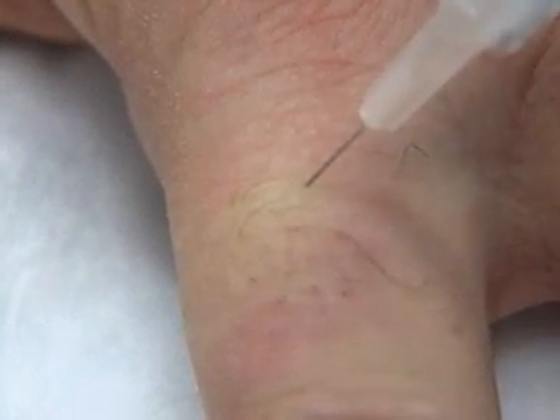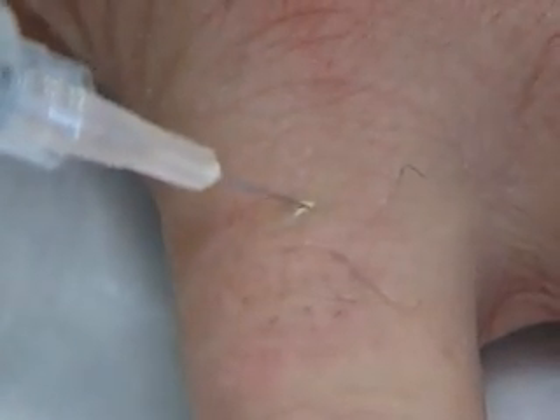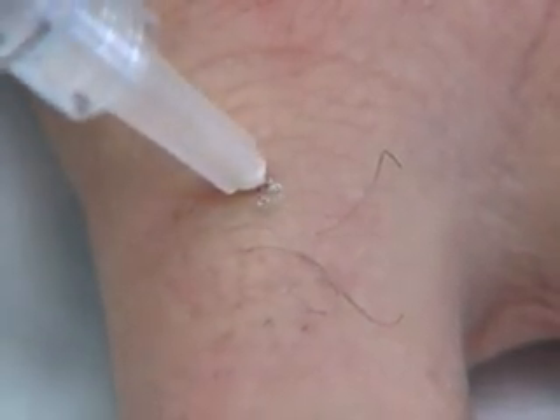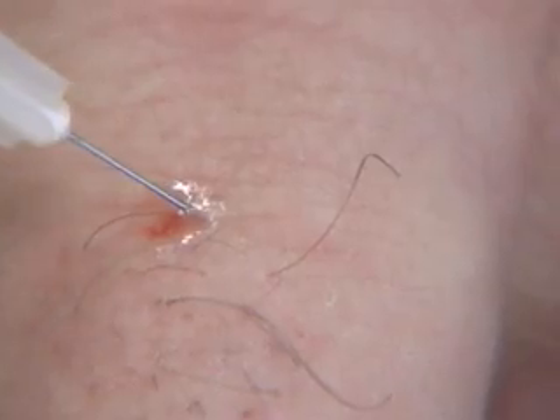To anesthetize the volar nerve branch, we'll withdraw the needle to just beneath the skin surface. Redirect downward, just lateral to the bone, until the skin is tented slightly on the volar side. Be sure you are not in the lumen of a blood vessel, then slowly inject another milliliter of anesthetic.